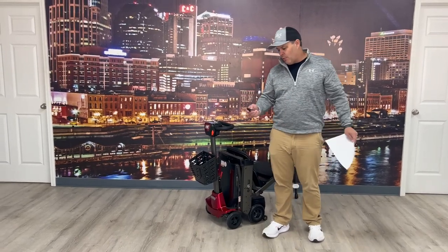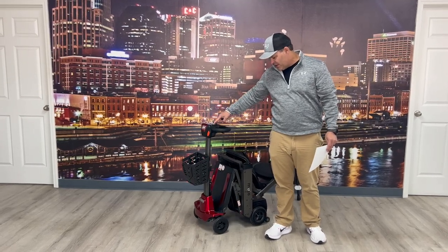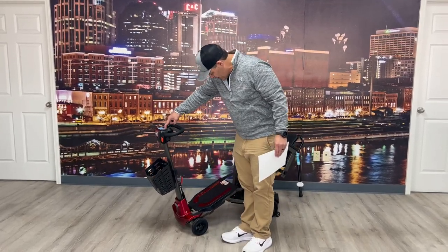I can open it back up by pushing this button here, or they actually have it on the tiller where I can do it as well, so you basically have two options to do that.